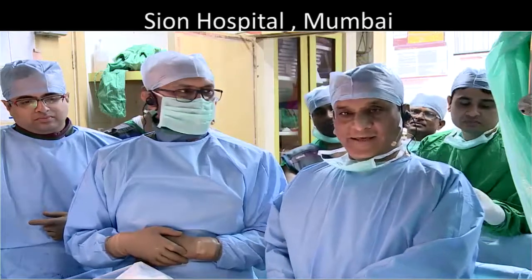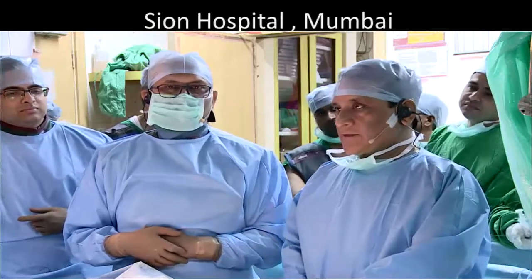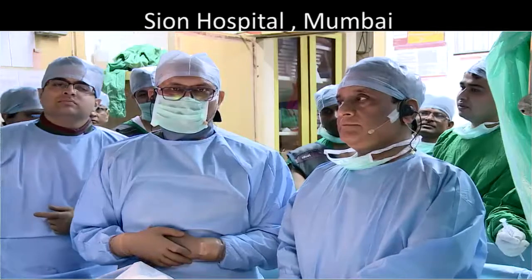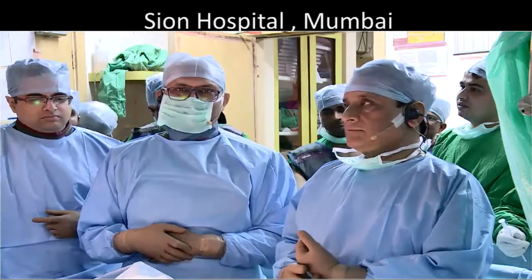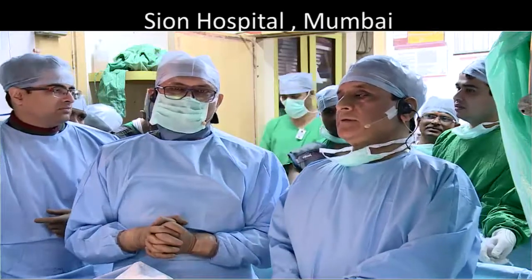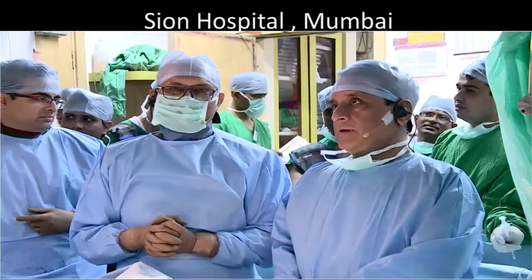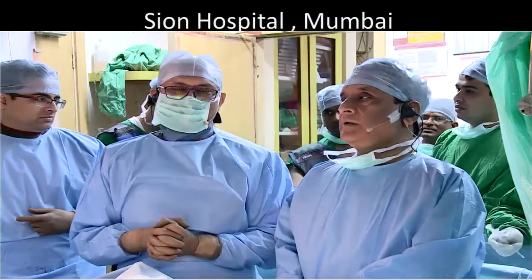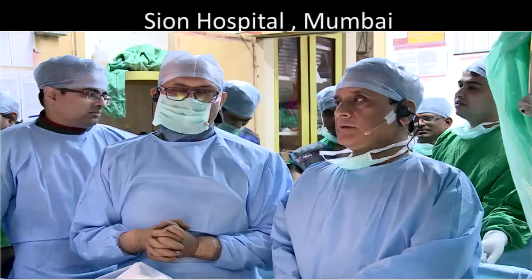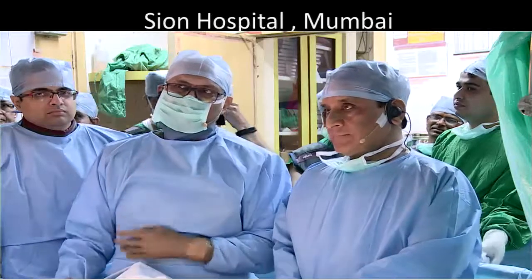And this is the coronary case. Dr. Mahajan, you tell a little history. He is a 58-year-old known case of diabetes, chronic stable angina, had rest angina on 15th of July, some elevation of enzymes, and then he was diagnosed as a non-ST elevation myocardial infarction, and the coronary angio picture is in front of you.